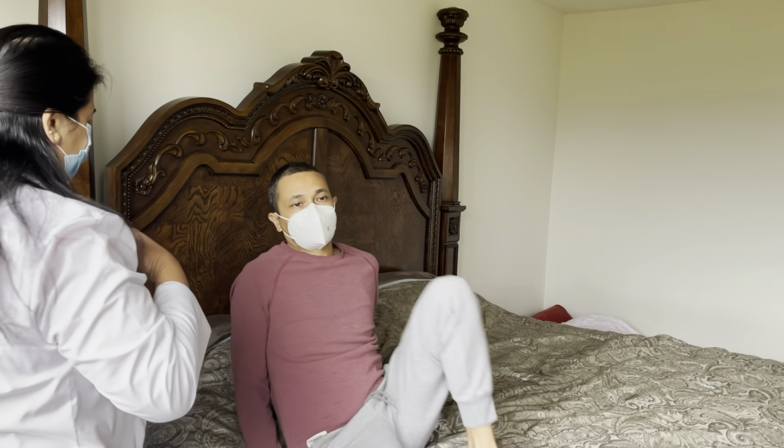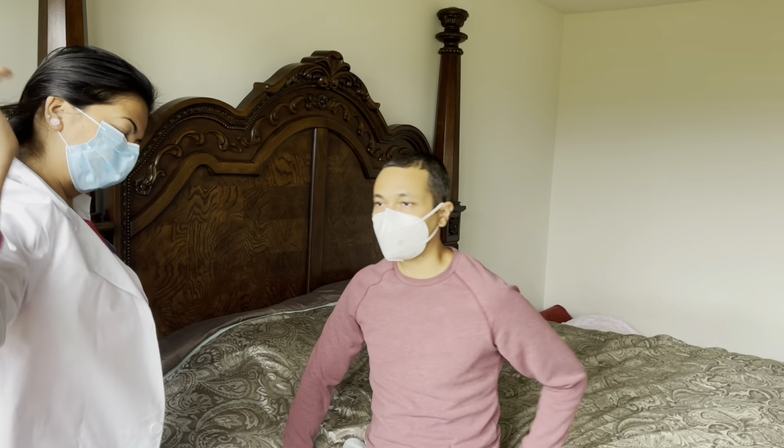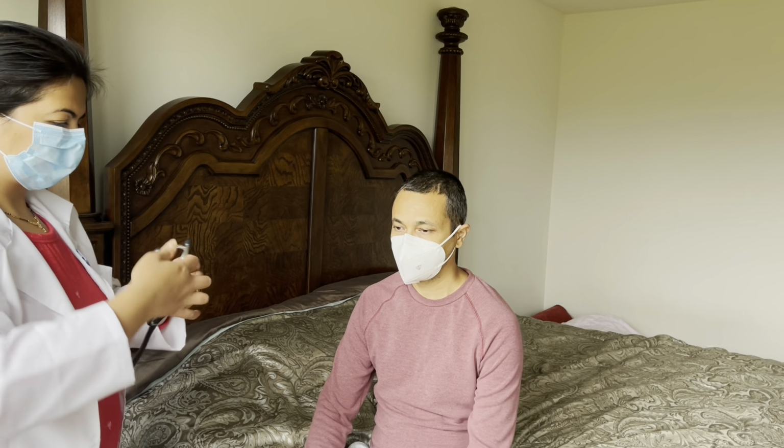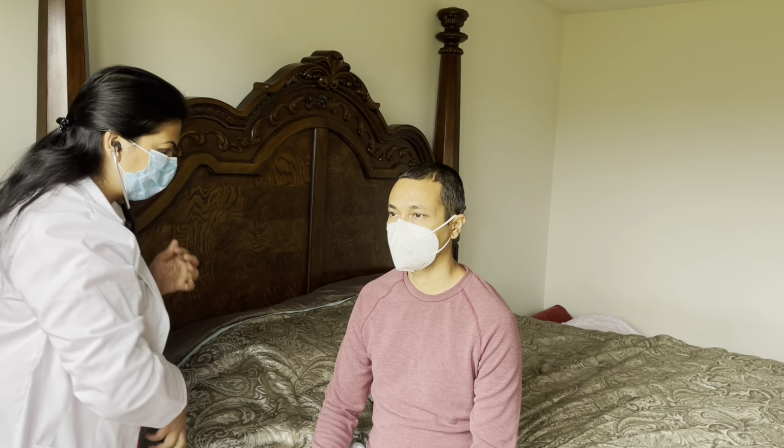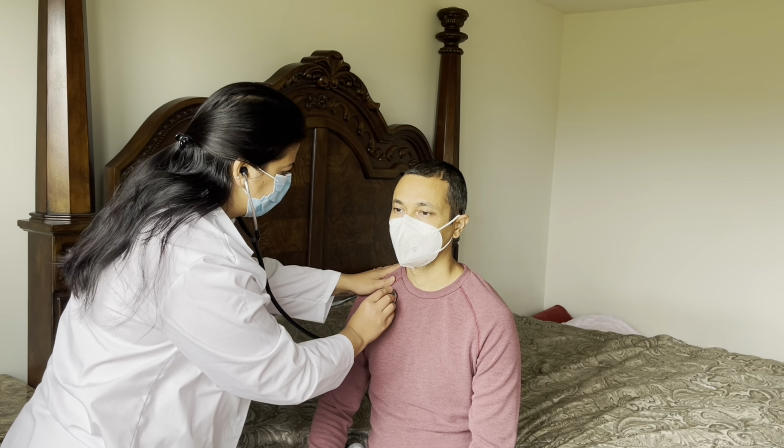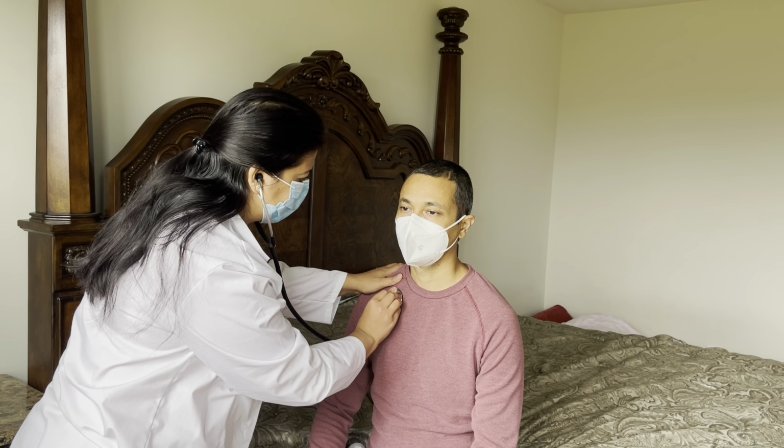And I'm going to listen to your lung sounds now, and I'm going to start from the apex here. Can you take a deep breath for me?